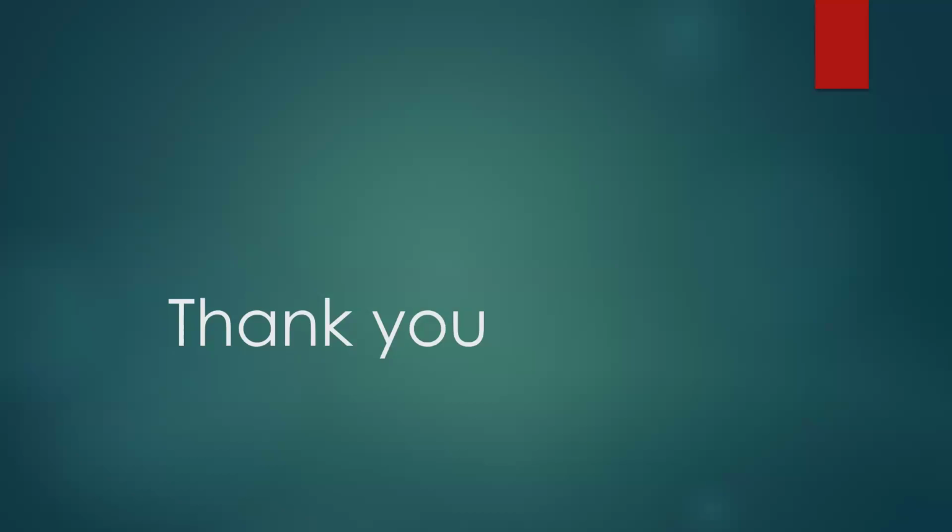خاصة إنه الكومبلكس فايبروادينوما هي بتدخل differential مع الفيلويدز أكتر، لأنه الكومبلكس فايبروادينوما بيكون فيها cystic changes، والفيلويدز بيكون فيها clefts or cystic changes. This is for biopsy، يعني حتى الكومبلكس فايبروادينوما it is for biopsy. BI-RADS 4 is not a BI-RADS 3، والفيلويدز is BI-RADS 4. It has to be biopsied.